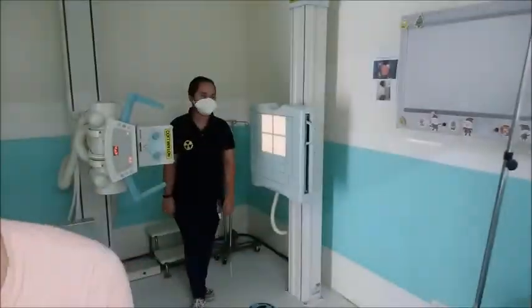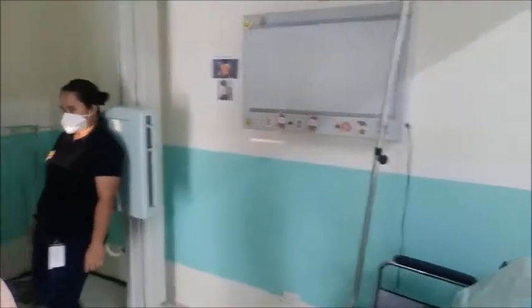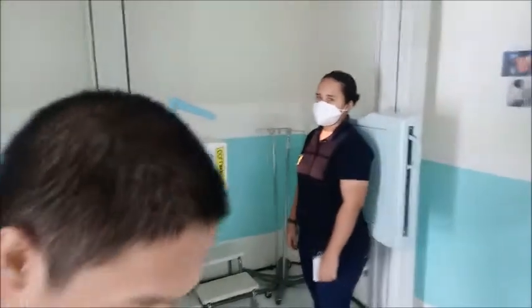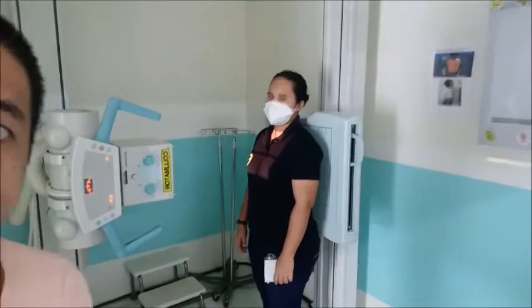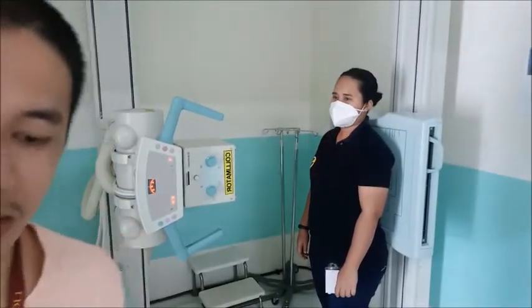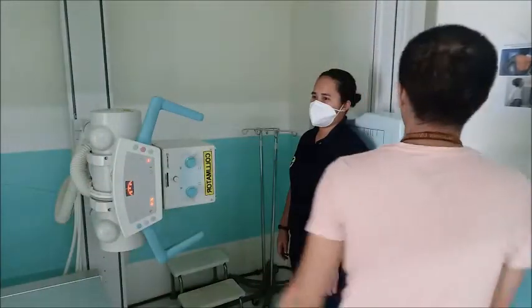So for the apicolordotic view, you have to ask the patient to stand in front of the chest stand, with his or her back against the bucky.